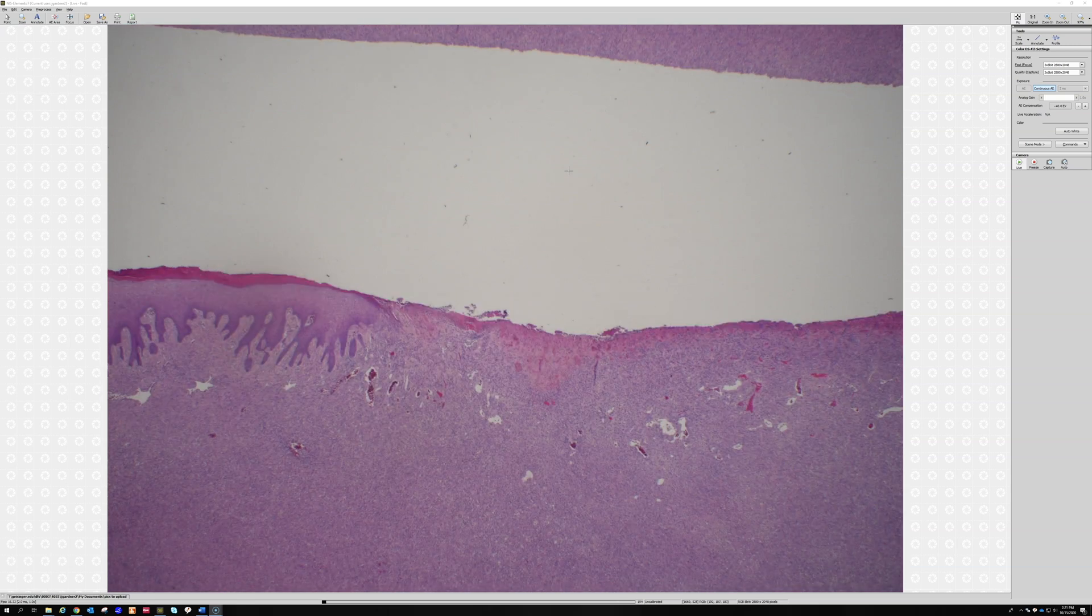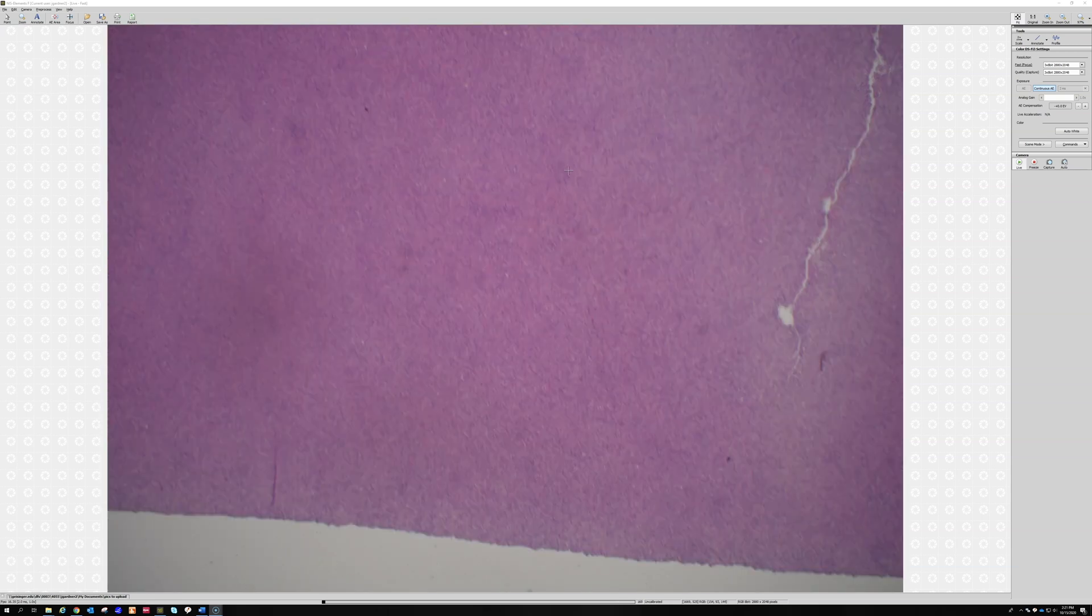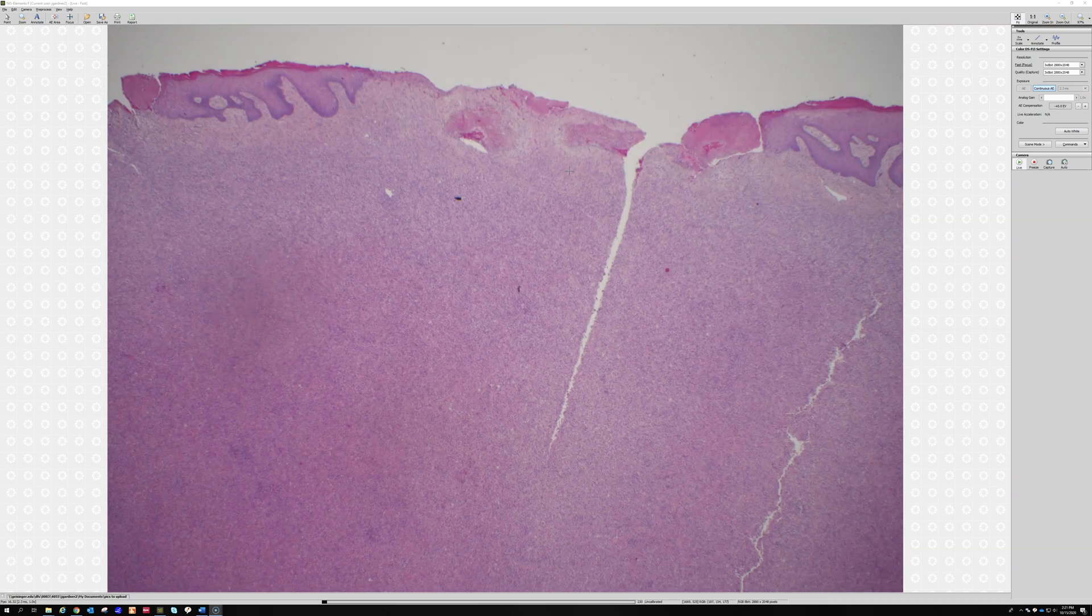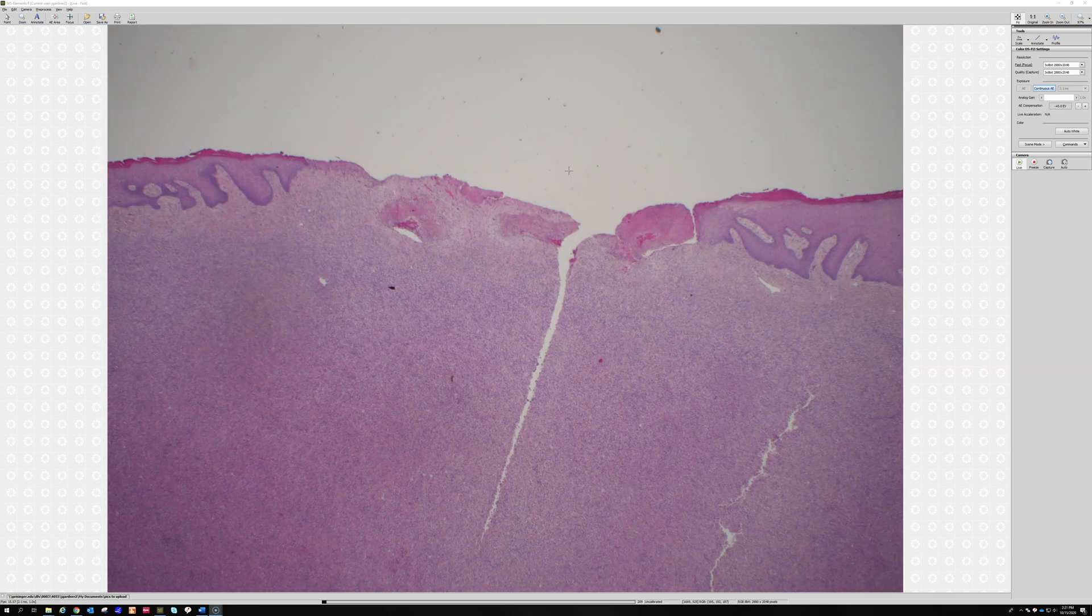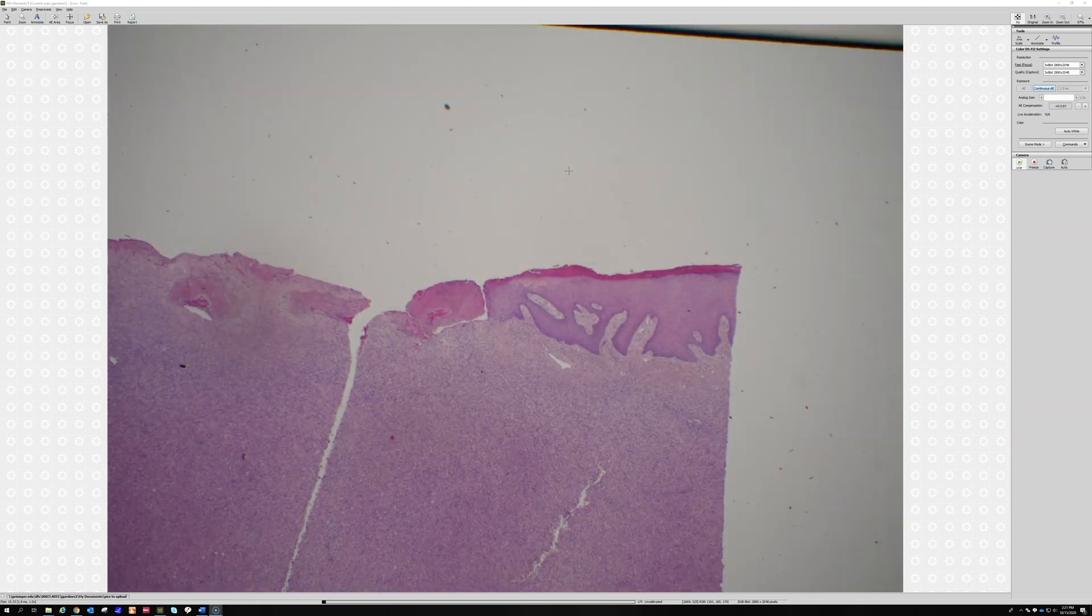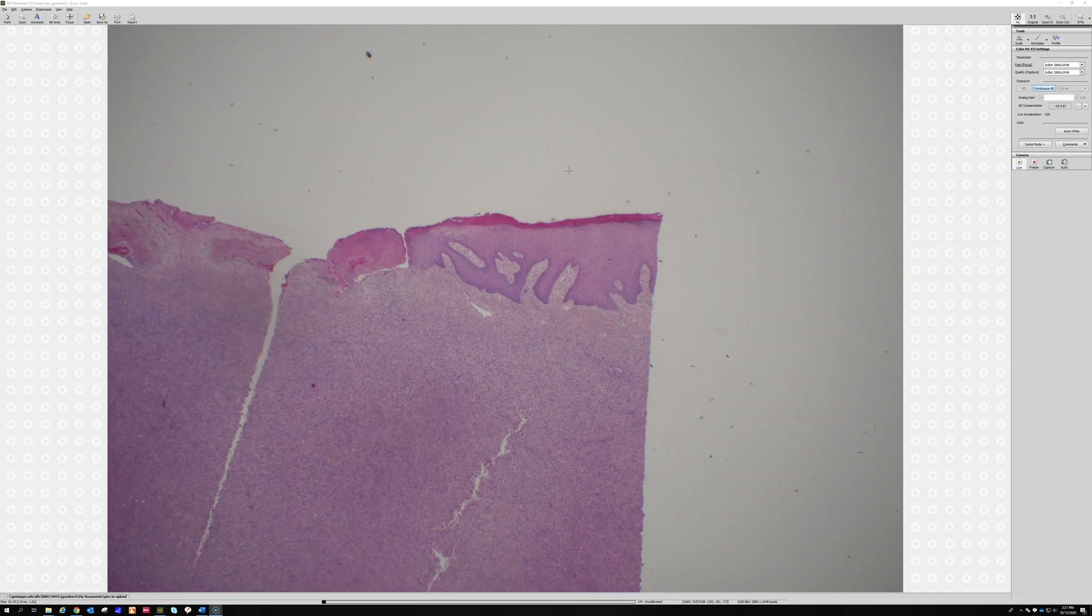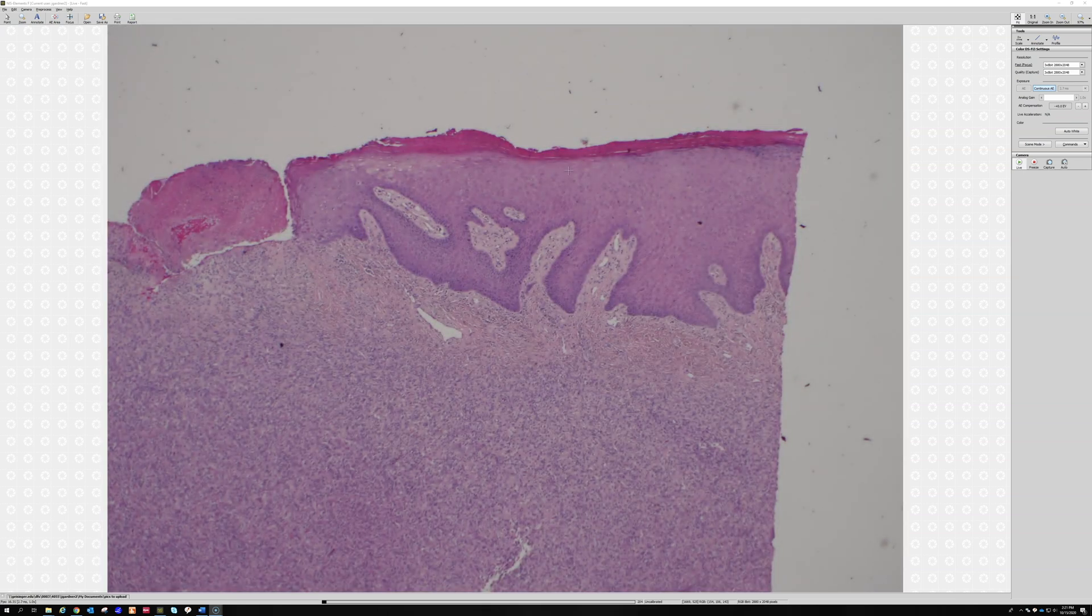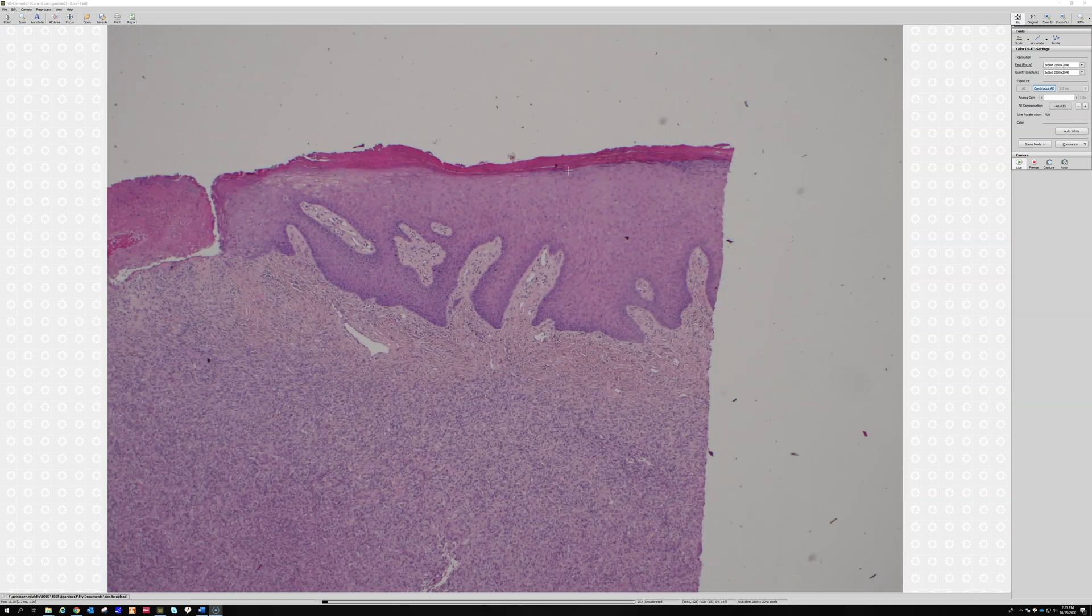Because there's so much ulcer and scratching, like keratinization or what we call secondary change, what the person has done to it with their fingernails, that really throws a lot of those clues out the window. When something's been scratched a bunch, it's really hard to know what's actually related to the scratching or what's part of the underlying primary tumor. This is kind of an example though of blunting or sort of tabling.